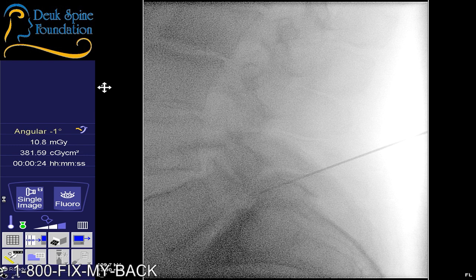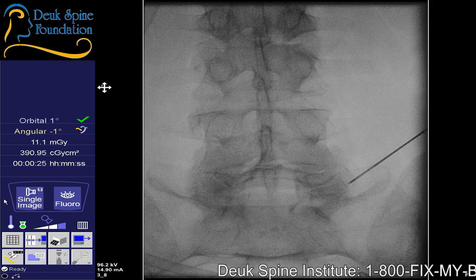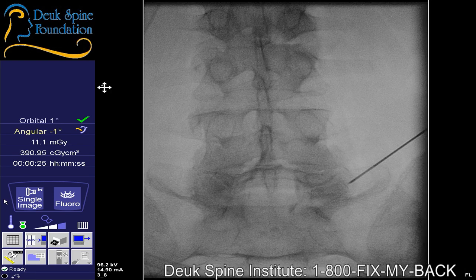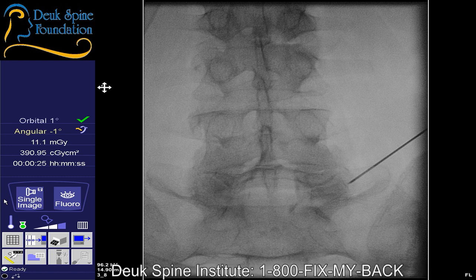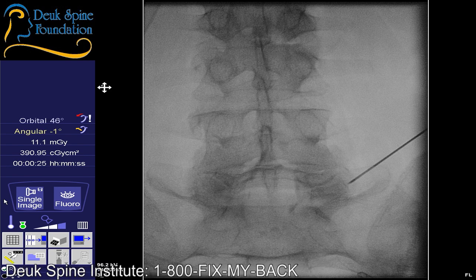Let's go with an AP real quick. Uh-huh. When was the accident? I see. Did you have back pain at the time? After the accident you had back pain? How long after the accident? Lateral. And it was right at the L5-S1 region? Yeah, you could have fractured it then. That's certainly possible. And likely.